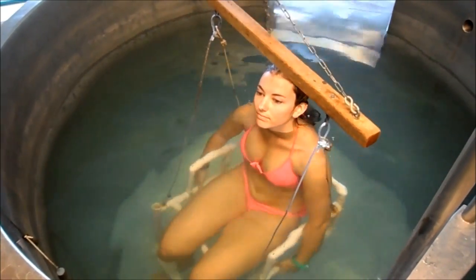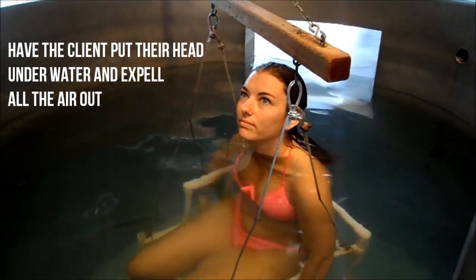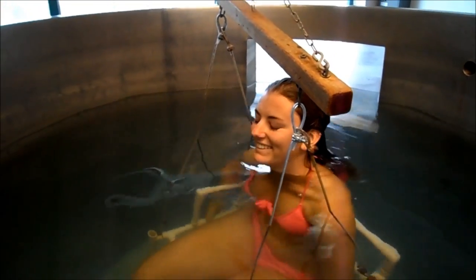When they're ready, tell them to put their head under water and expel all the air from their lungs. Any air left in the lungs will be counted as fat — that's a good motivator to get them to get all their air out.